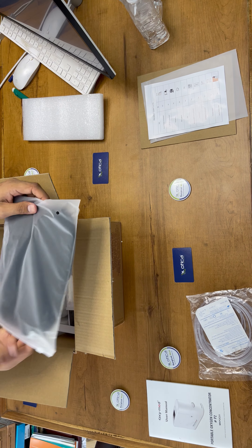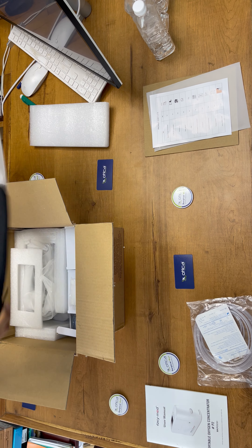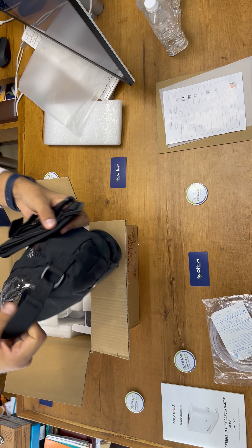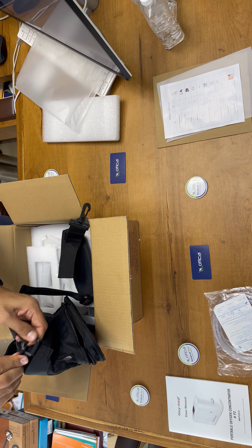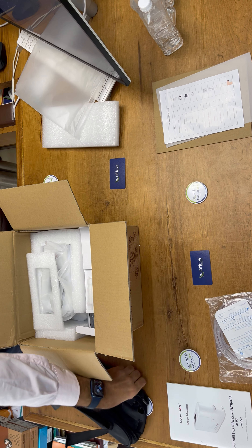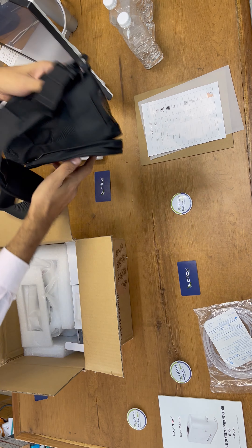First of all, they have given this carry bag. This is a very good quality carry bag. We have to insert the device in this. It comes with a two-in-one hand carry and a belt carry — you can attach this belt here. So this is the carrying bag.